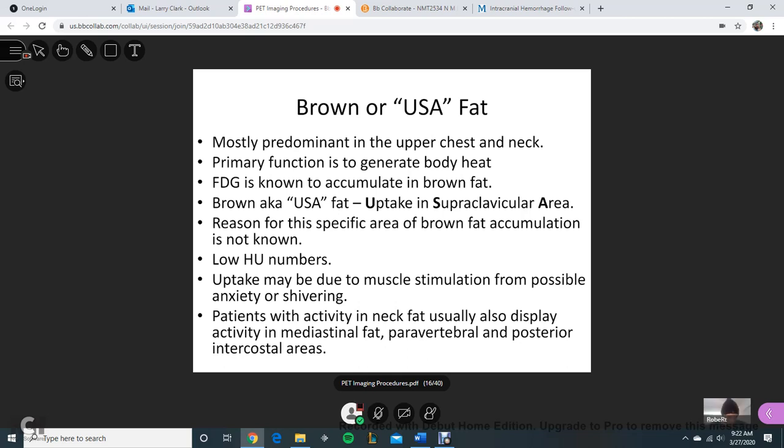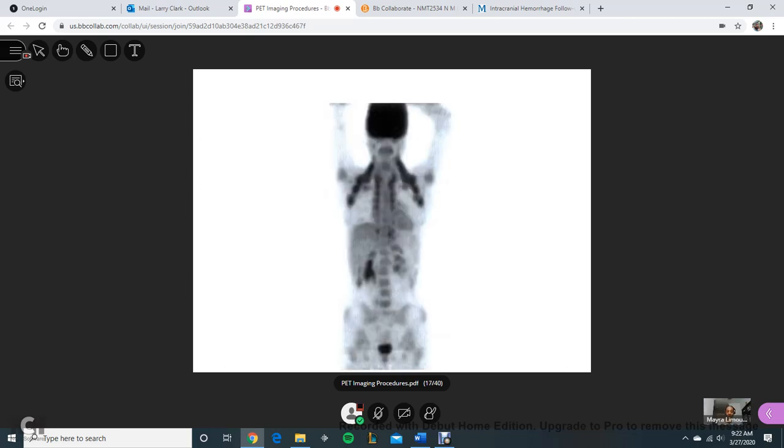Did you even know what that was? Maybe let me show you this picture so you can see. Did you see this before? No? Good, then you are keeping your patient nice and warm. Because that's exactly what it would be right here, and then in that mediastinal area.